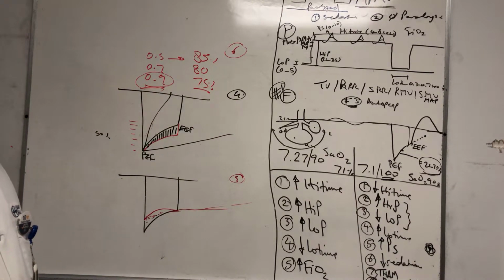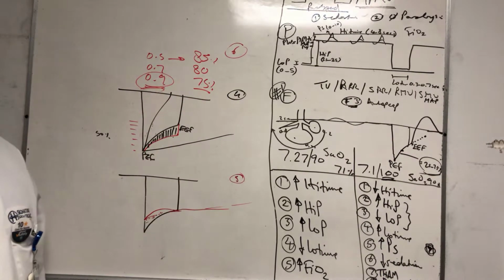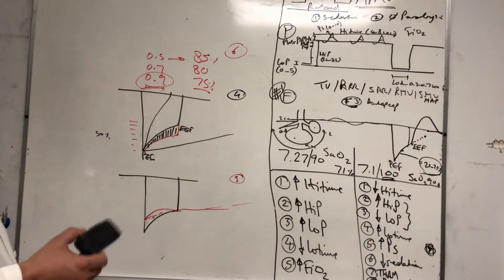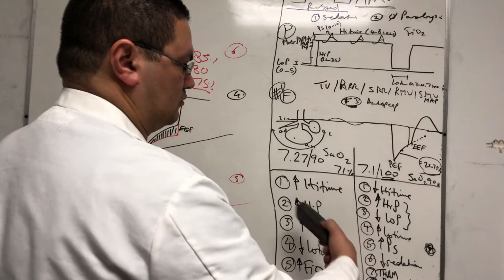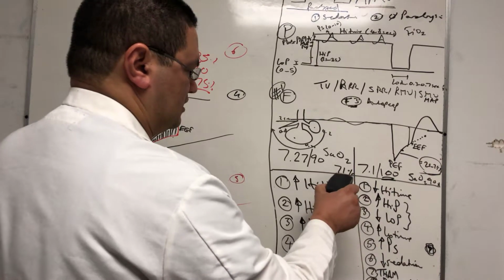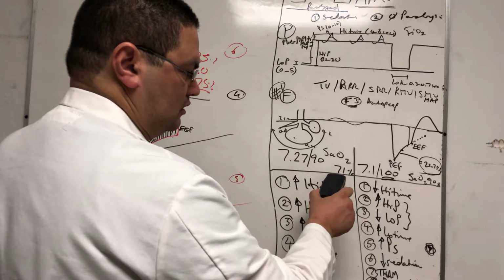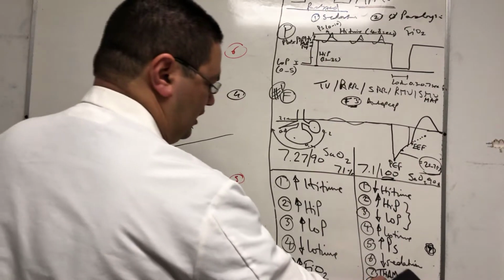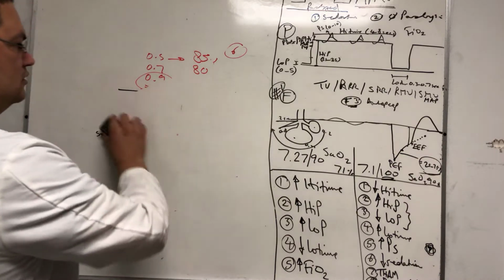You know what I mean? It's more of a hypoxia mode of ventilation, this one. The bilevel is the opposite. Or, both of them are good for both, but APRV is good for both, better than other modes for both. But this is the claim to fame. The hypoxia is where the mode actually excels much higher than anything else. This one will lag a little bit, so that's why these adjuvants have to be thought about a little bit earlier. What is THAM?